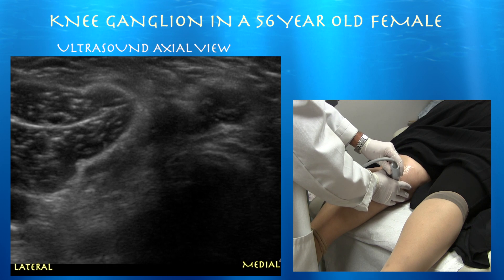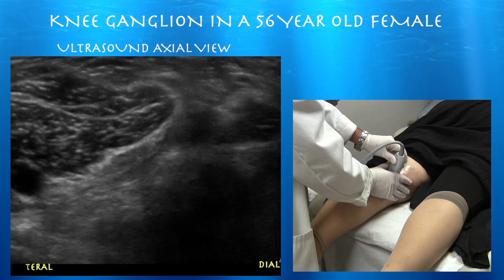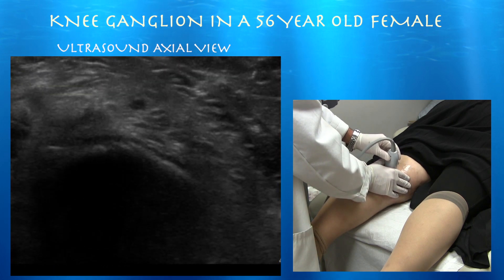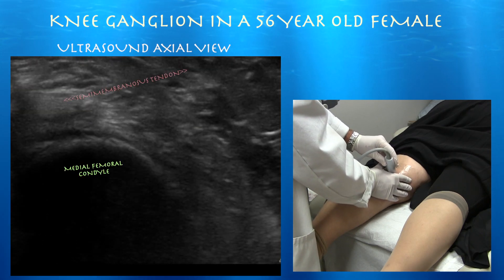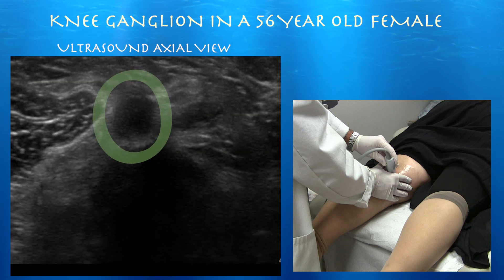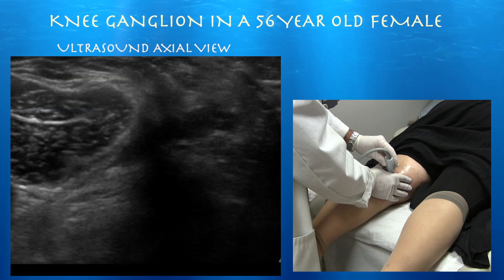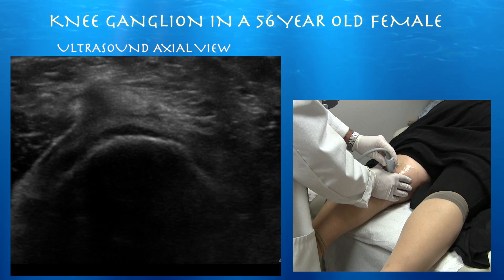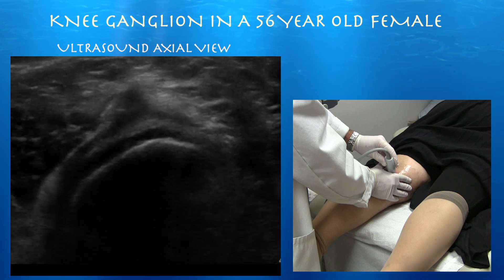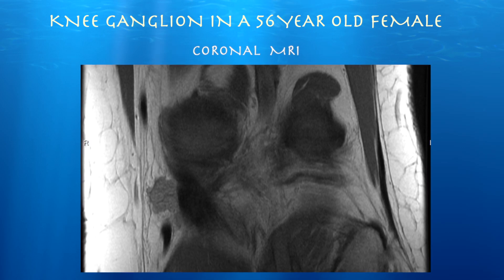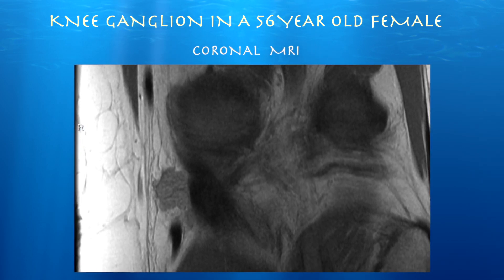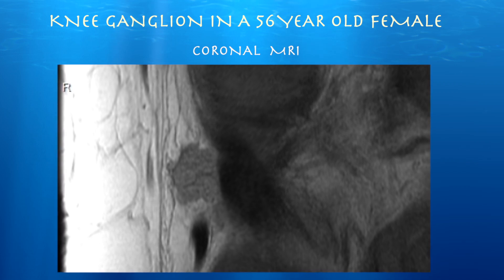It's going out of view because the probe is just angling away. Now watch what happens when I go over the semimembranosus tendon and toggle it — you can see that tendon appear. The tendon when you toggle will go in and out of view, unlike a ganglion. We're toggling the probe and you can see the semimembranosus tendon turning from a black circle to a white circle. The ganglion stays black the whole time — when you toggle the probe, either you'll see it or it'll just go out of view. Here we are zoomed in on the ganglion cyst, which you can see protruding medially just next to the semimembranosus tendon.